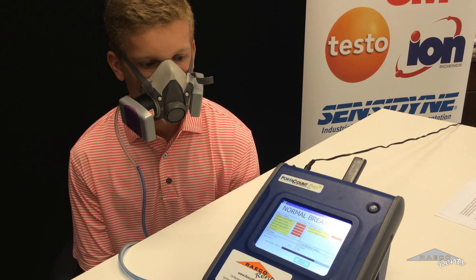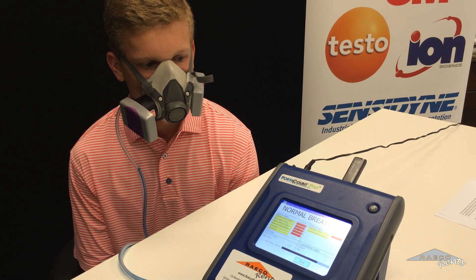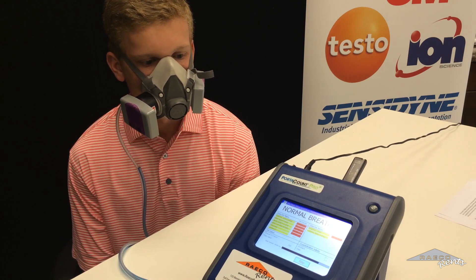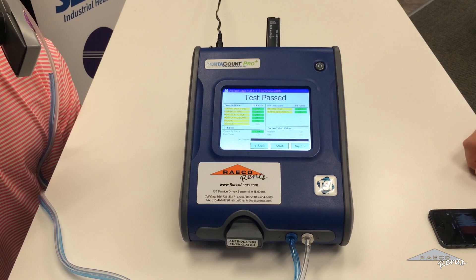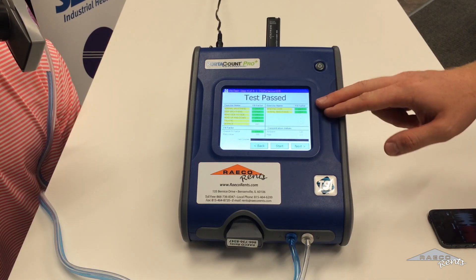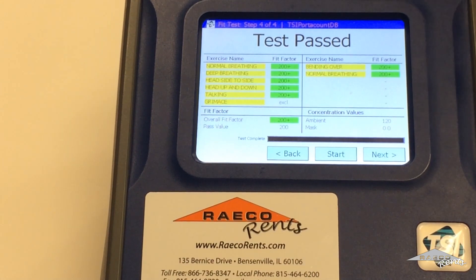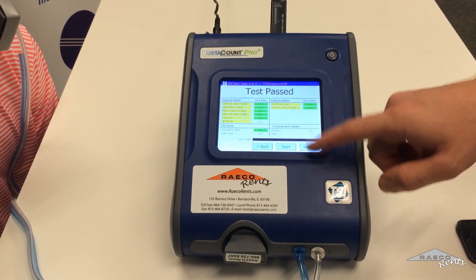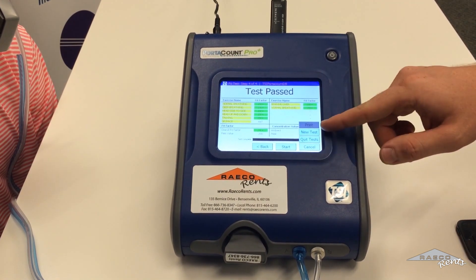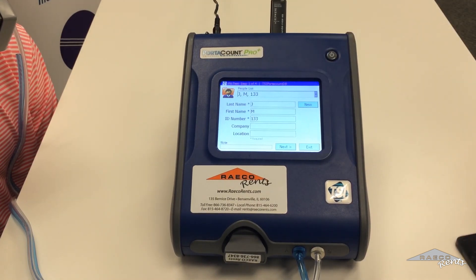When it's done, it should automatically save to the flash drive, so a little notification will pop up. We've finished the fit test — you can see we've got a fit factor over 200 on all of these and he passed the test. Right after it does that, it automatically saves to the USB. If you want to run another test, just hit next, new test, and go through all the same steps as before.